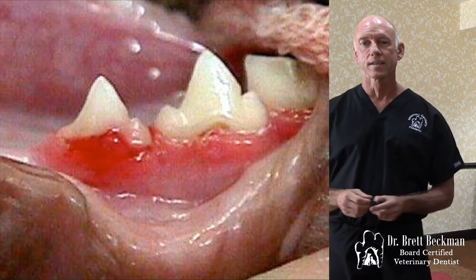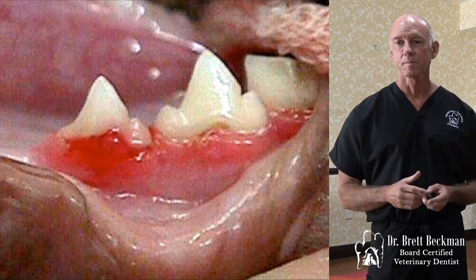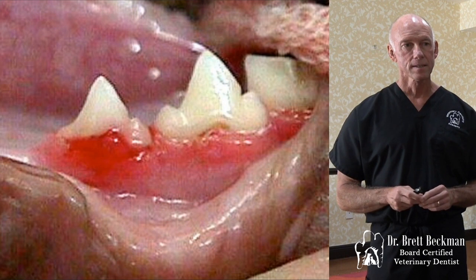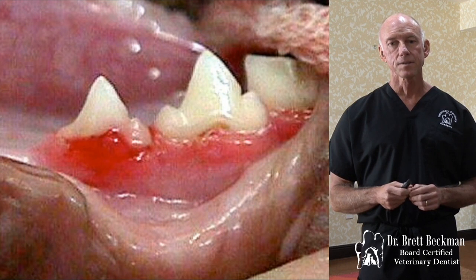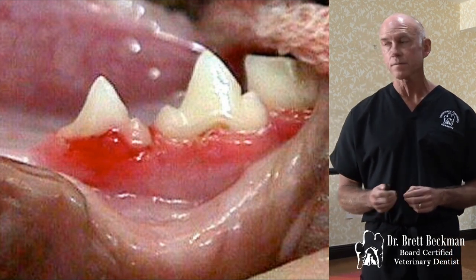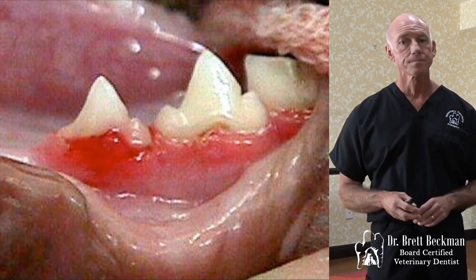So this is a good image, although this is an old image. This is a good image of a tooth that's got both types of tooth resorption and one that's also got perio. So that tooth on the left side of the screen, 307, has a big defect in the crown. And you can see that on the tooth next to it, there's a zone of erythema that's pretty much parallel to the margin. And then underneath, apically to that, you've got all that nice pink normal tissue.